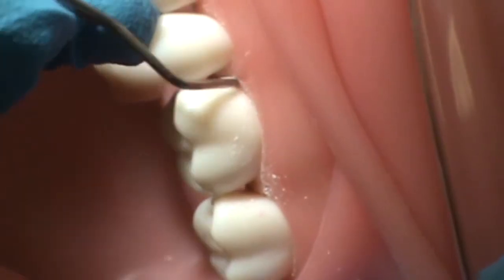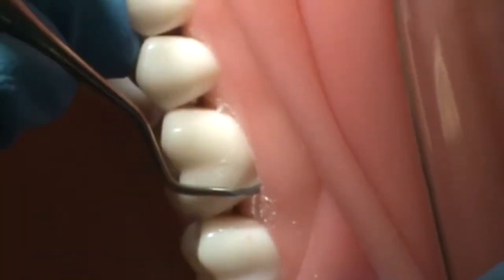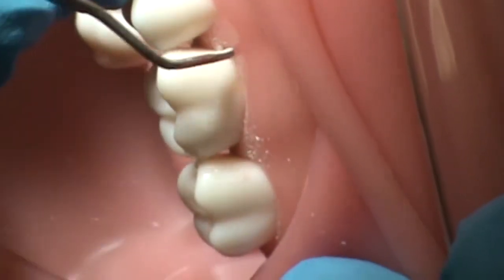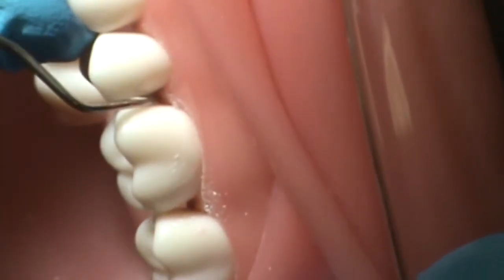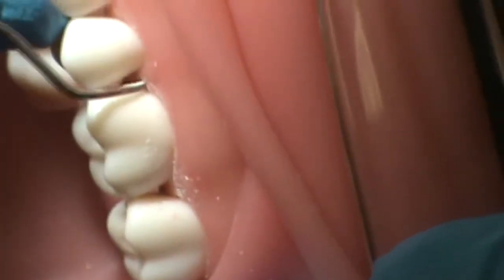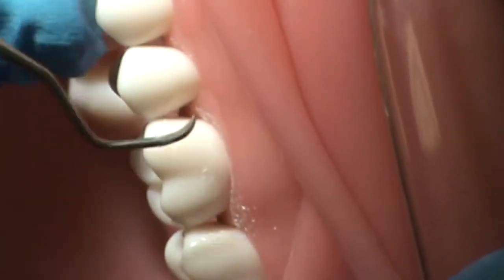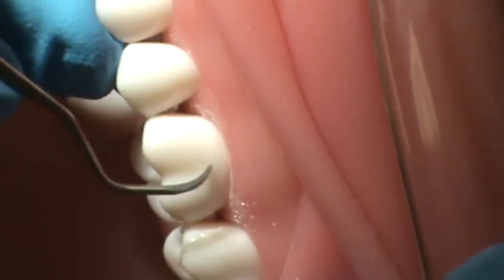She will roll the instrument handle as she moves across the facial surface, especially at the mesial facial line angle. Her strokes will extend into the inner proximal and under the contact, all the while utilizing a wrist rock motion as compared to finger motion.